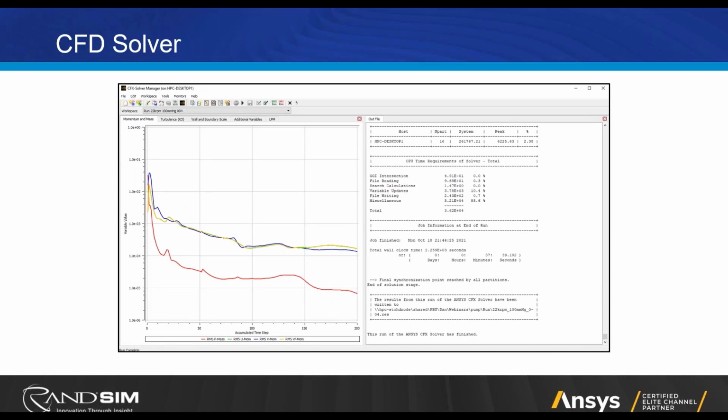It allows you to monitor the progress of your simulation. What you're looking at here is a graph of the residuals, which is the amount of imbalance. So it's an iterative process when we solve these problems. The grid that I showed you earlier, basically the code is looking at a balance of mass, energy, momentum in and out of each of those cells in your domain. And this is a measure of the imbalance or the leftover from that. What goes in does not exactly equal what goes out. And this is telling you how it's doing as time goes on.